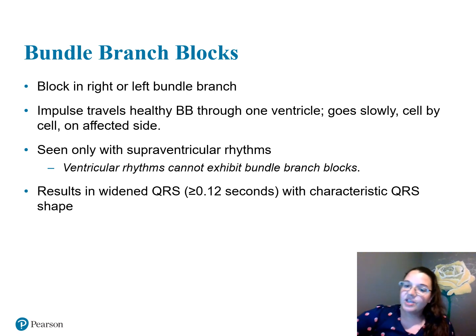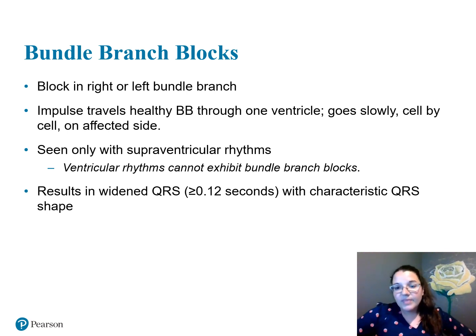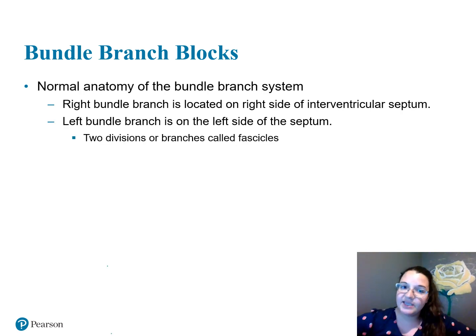So remember, a hint to know if your rhythm is coming from the sinus node, the atrium, the junction, or the ventricles is if we have a wide QRS, ventricle, okay? Remember that from EKG1. The normal anatomy of the bundle branch block system.